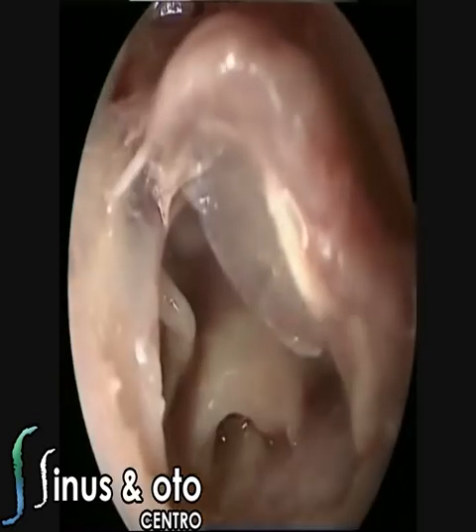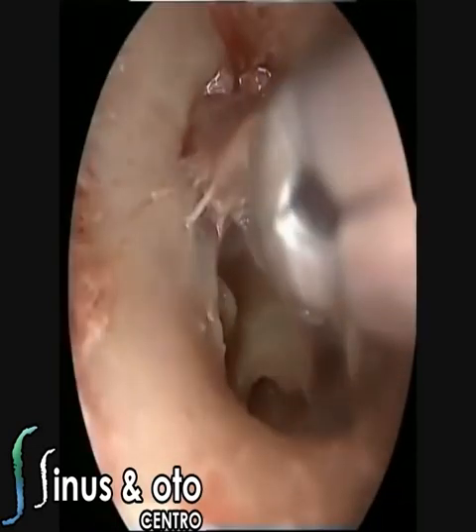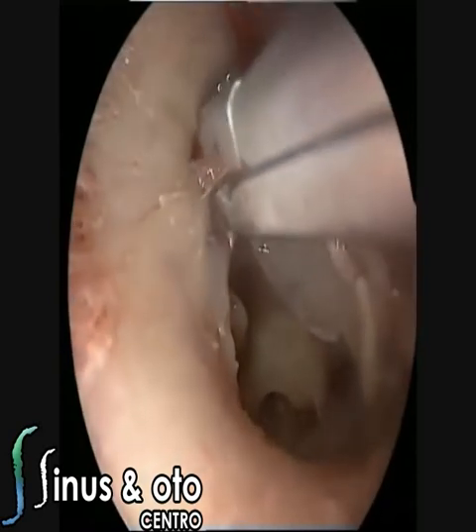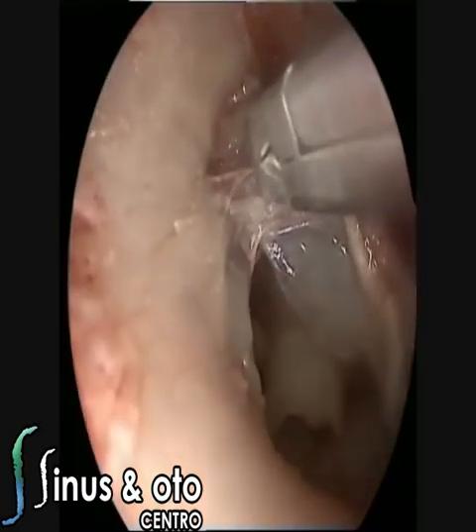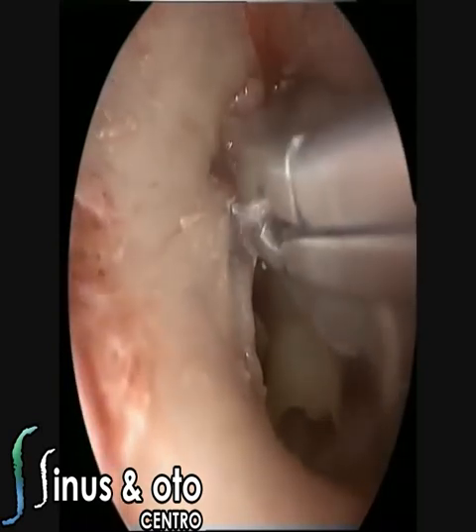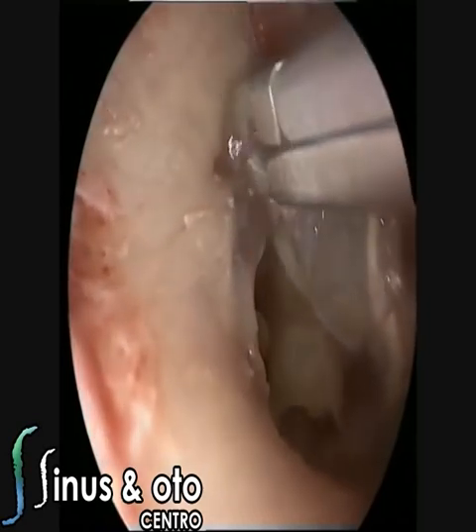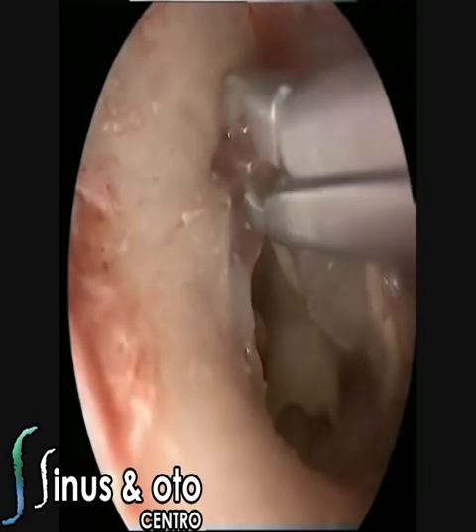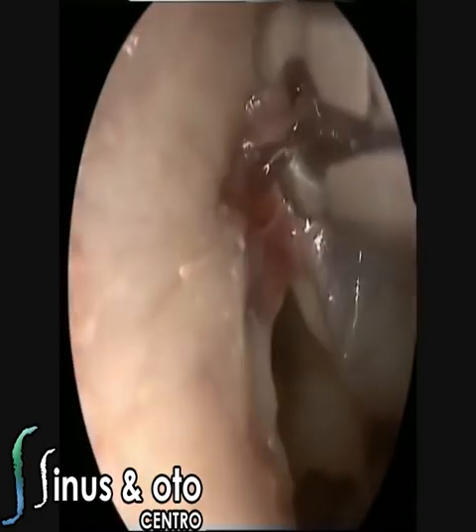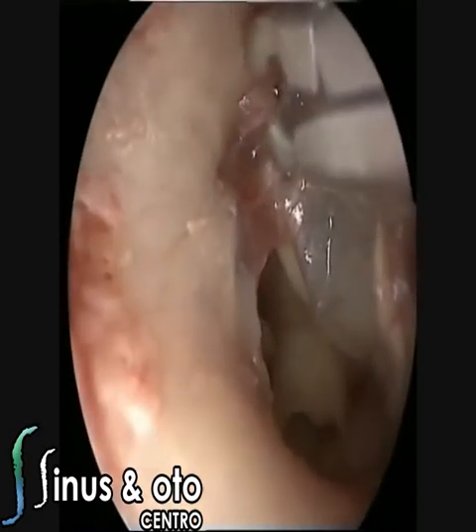Of course, once you elevate more, you can see the posterior malleolar spine here, which is the home plate of the posterior malleolar ligament. The posterior malleolar ligament is one of the ligaments that suspends the malleus, one of the three ossicles of the hearing. So you have the posterior malleolar spine and then the posterior malleolar ligament, which is a very nice ligament. And this ligament is over the chorda tympani. So once you remove this ligament, you can see the chorda tympani nerve.